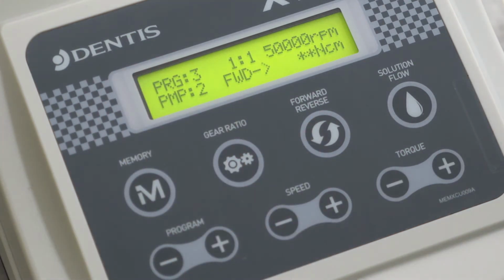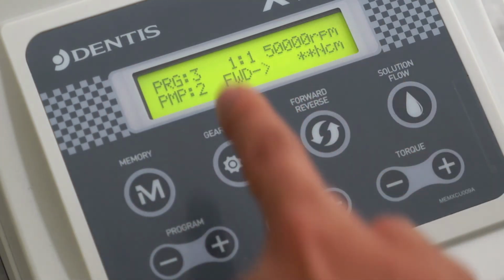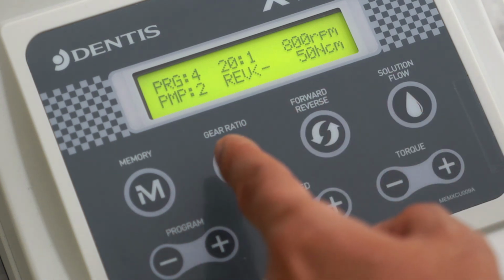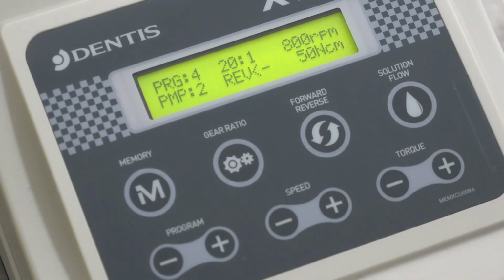Program 3 is set for a 1:1 gear ratio, and it's generally used for bone reduction. It's forward. You can have the pump set at 2, but you can go up to 3 or 4 depending on how much irrigation you desire. And for myself, because I do osteodensification, that's the setting for the Versa drills, and it's recommended by the manufacturer, where you go in reverse at 50 Newton centimeters and 800 RPM.